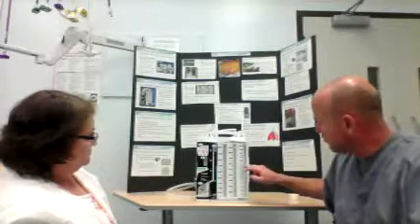Oh, one thing we didn't cover is what to look for in the drainage. Say you get a patient up who's had a chest tube for 3 days, and they've been sleeping all night, and you get them up in the morning to walk them, and of course the good nurse you're going to be, you look at your drainage system and you say, oh, there's 100 cc's in there. Then after you walk them, you notice there's 180, and it's dark, very dark, dark black or dark brown drainage. Is that something to worry about? No. Reasons why is the patient's been sedentary all night, you've gotten them up, you've moved positions, you've got them ambulating, so all that, if it's old dry blood that's in there, you would expect that to come out as a dark brown.